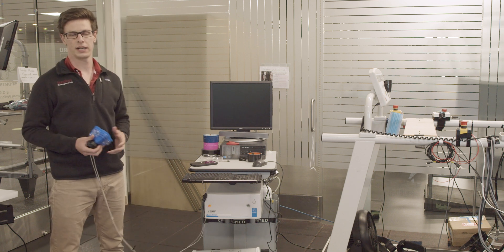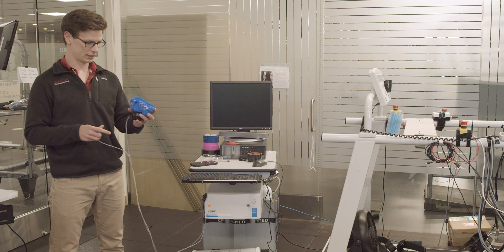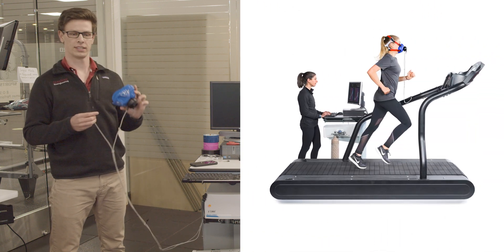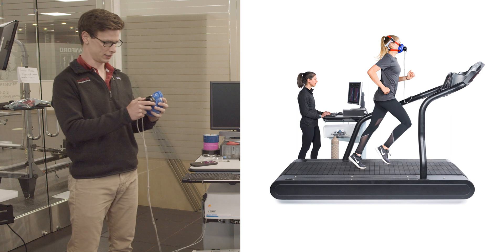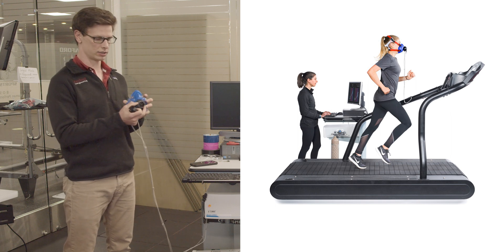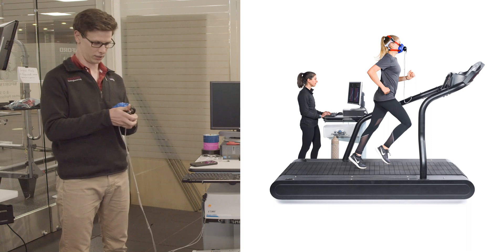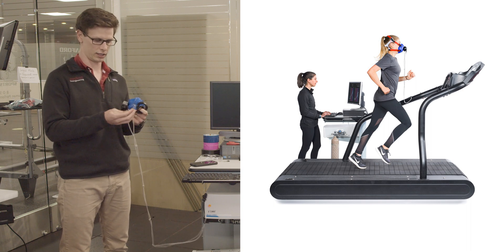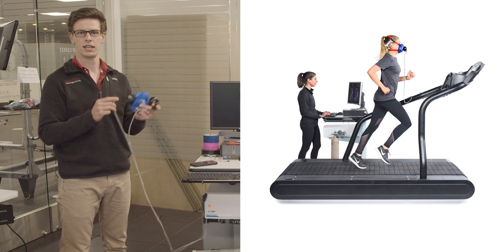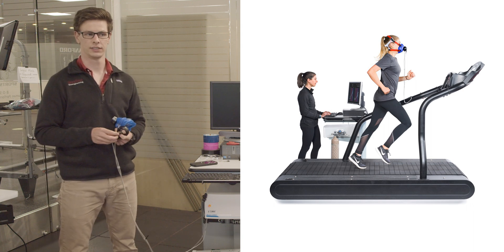Once we know the room air composition, we have somebody put on this mask over their mouth. There's a turbine inside that measures the flow rate of air in and out of their mouth, and also a small straw-like device that pulls the air people are breathing out and analyzes how much oxygen someone is using during an activity.